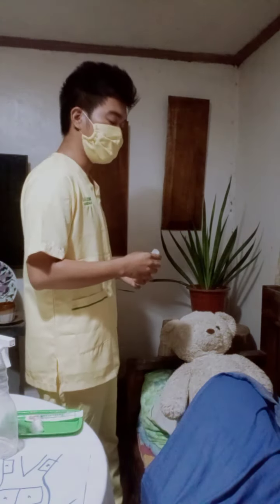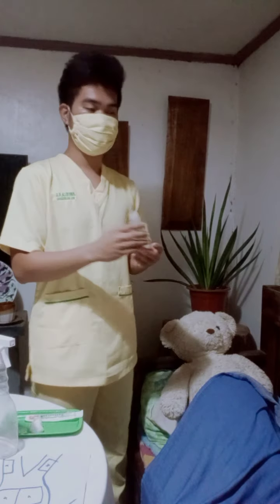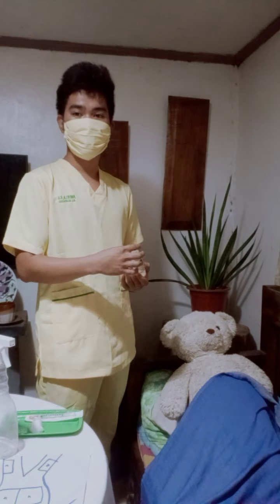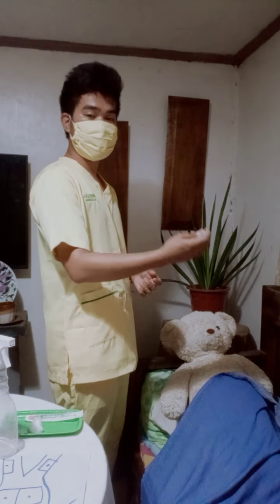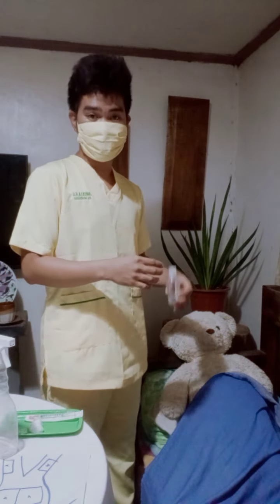If the medication is insulin, have the patient inspect for a change of color and warm it to room temperature. We're going to give it to the patient and explain what the labels are, and the expiration date of the vial, of course, to prevent introducing expired insulin to our patient.